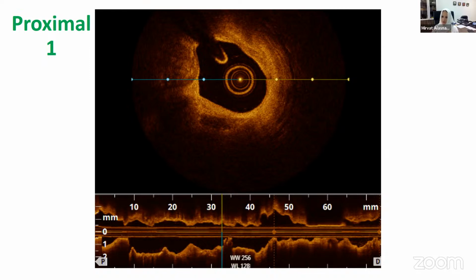Shockwave just tends to, in my opinion, a little bit like laser, make it softer and more susceptible to the next technology that I bring in. But I don't think it modifies it enough. The next thing is to bring in something like either orbital atherectomy or rotablation that actually starts to do a lot more shaving as it's going along, and just removing some of that content that hopefully was already slightly fragmented by the lithotripsy.